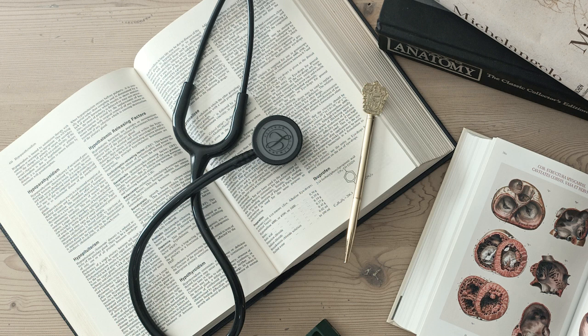And the ECG. On ECG, you'll always see that widened QRS complex, typically greater than 0.12 seconds. The electrical axis is typically toward leads facing the left ventricle, such as V5 and V6, where you'll see a broad, often notched or slurred R wave. It might look like an M shape sometimes. Conversely, it's away from leads facing the right ventricle, like V1 and V2, where you'll often see a deep, wide S wave, maybe looking like a W. You might also see a left-shifted vertical plane electrical axis moving towards lead aVL. It's a very distinctive pattern once you learn to spot it: wide QRS, characteristic changes in V1 and V6.